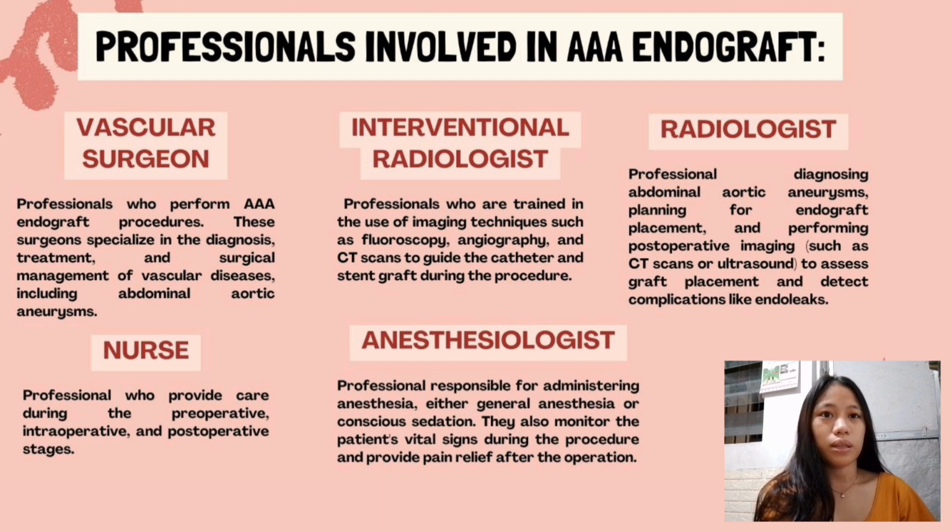Ang primary specialist, vascular surgeons are the primary professionals who perform abdominal aortic aneurysm endograft procedures in the Philippines. Sila po yung surgeon na nag-specialize ng diagnosis, treatment, and surgical management of vascular diseases, including abdominal aortic aneurysm.